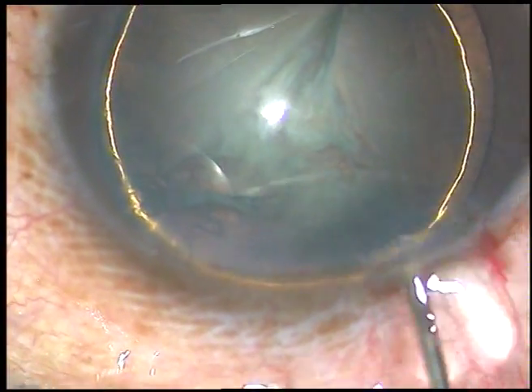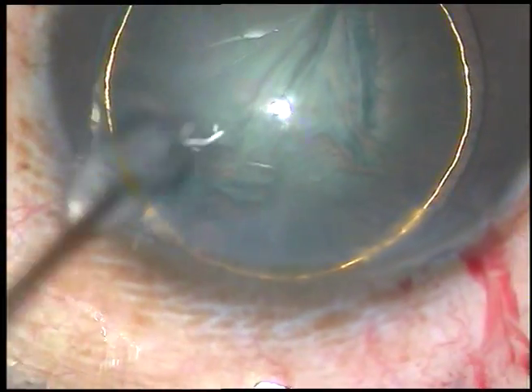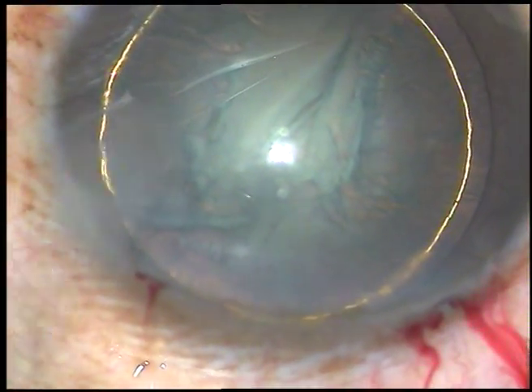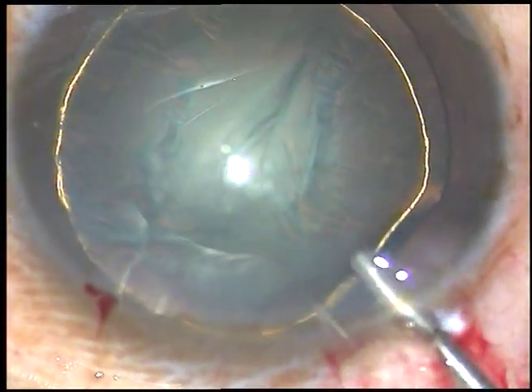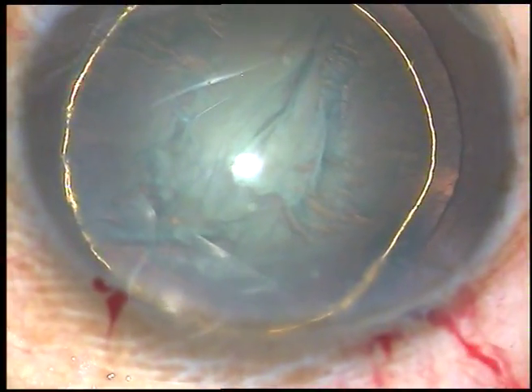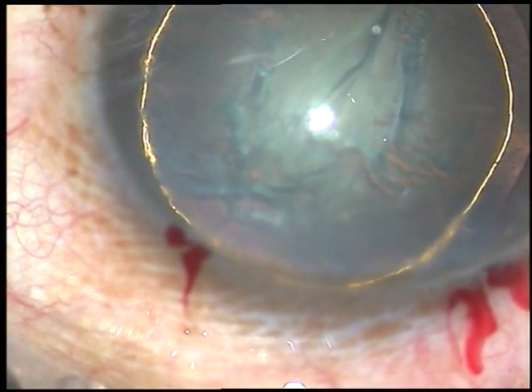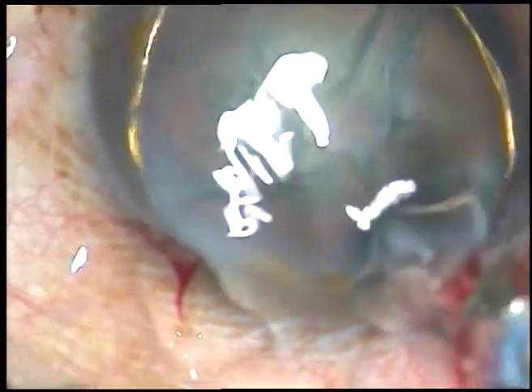Now hydrodissection as well as hydrodelineation has been done in this case. Hydrodelineation has produced a beautiful, very bright golden ring. Now viscoelastic substance is injected again.